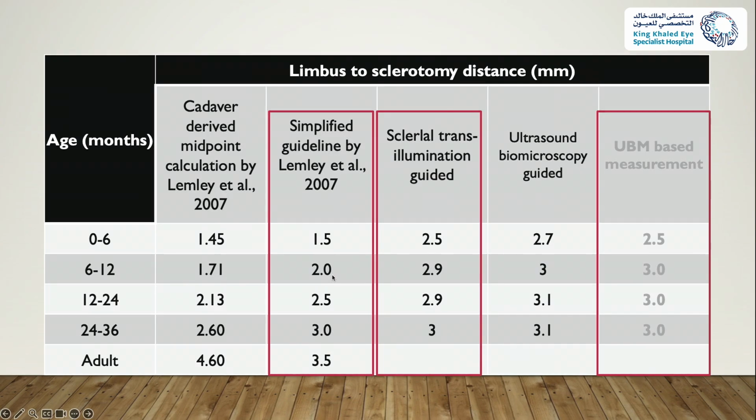If you think about it, it probably makes sense for several reasons. One is that the post-mortem cadaver eye may be a little smaller. So if you have been using the Lamley's recommendation, that's quite safe. And that's also the reason why that big range of numbers hasn't caused a lot of problems to the retina, because the number itself is more generous than we think.